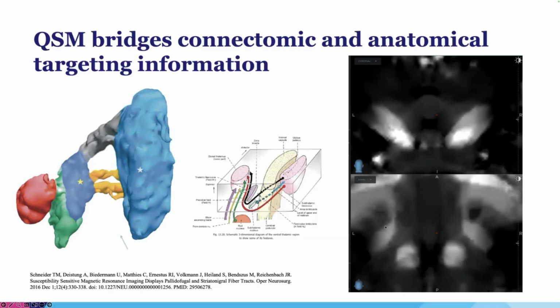This one patient essentially was not able to get into that because of the shape, and had a lot of stimulation-induced dyskinesias. When we moved the electrode a little more anteriorly to get into that ansa, we were able to resolve that. So it's just an anecdotal example. But the fact that QSM can resolve this sort of connectomic information without traditional tractographic targeting is pretty impressive.